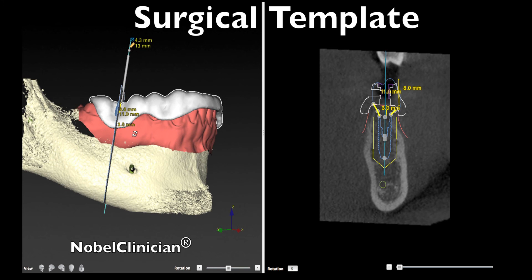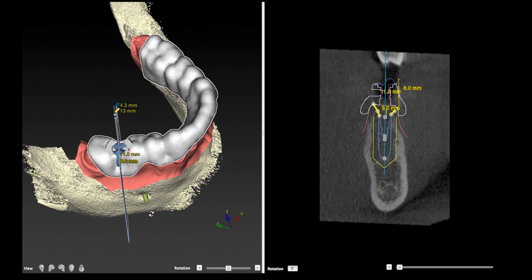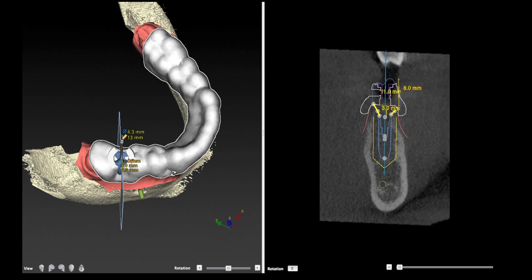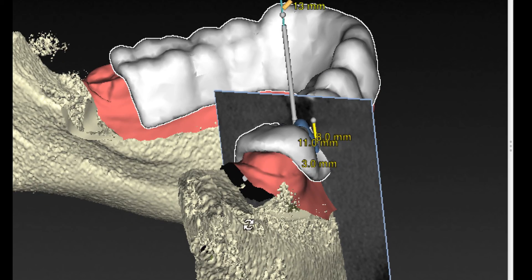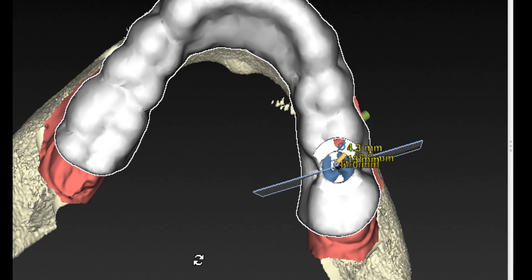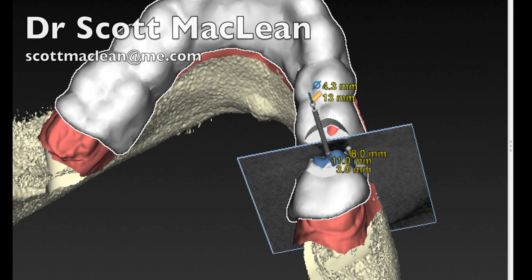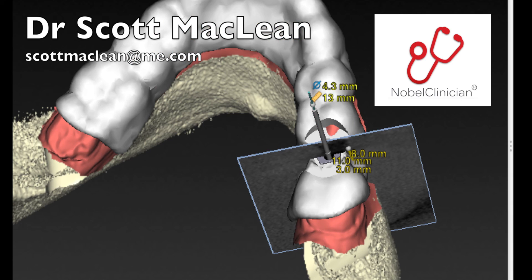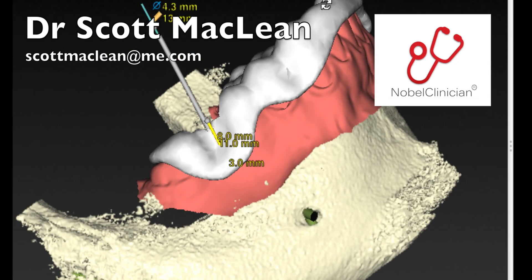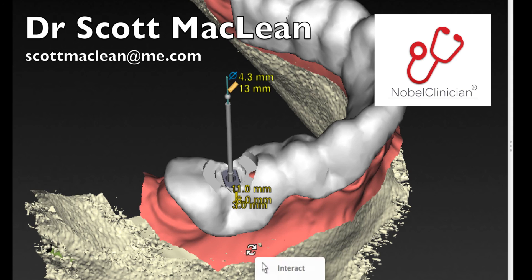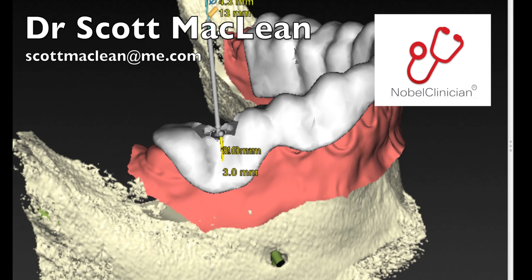The site will have to be flapped before the template goes in, so you must be capable of those procedures before placing the template. Check the template on the model, but since the model has been reduced, make sure the tissue is out of the way. Check by looking at the windows and ensuring the template is fully seated at the time of surgery — this ensures proper depth and angulation for final implant placement. Really cool technology — plan where you want it, then put it where you planned it. This is Dr. Scott McLean, and this has been a presentation about implant dentistry.